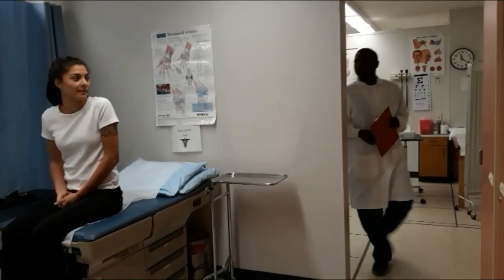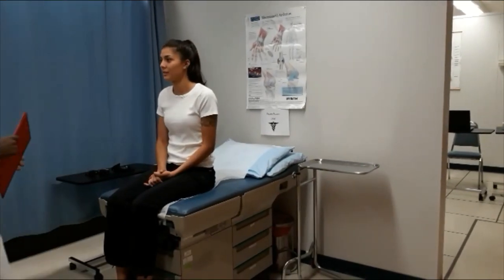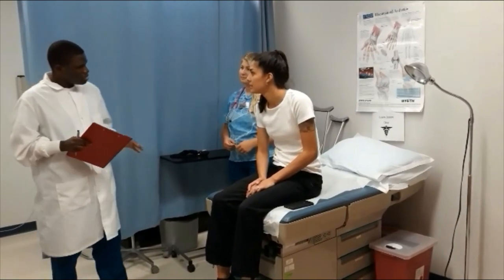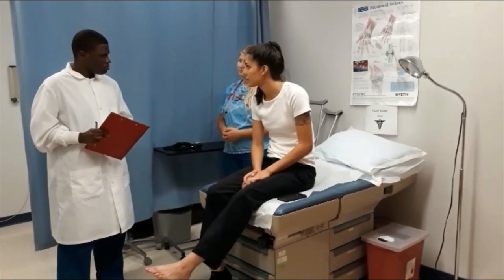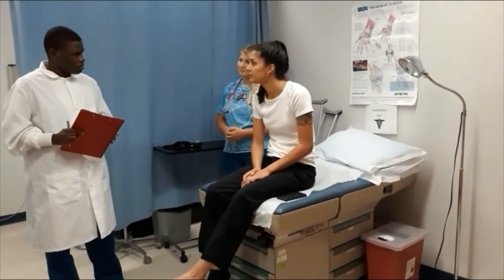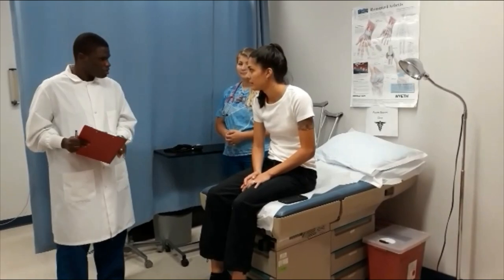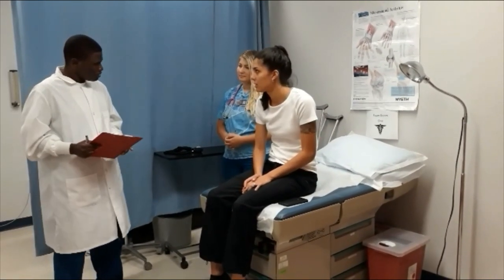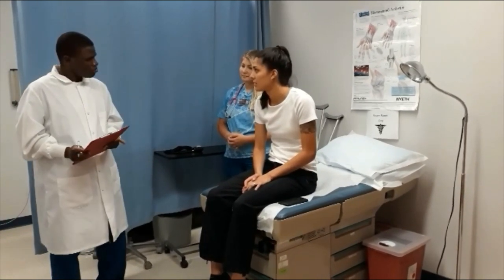Come in. Hi Isabel. My name is Dr. Simon. Nice to meet you. I see you're here for the wart removal. So today I'm going to explain the procedure. First I'm going to place a local anesthetic on your foot to make it numb. Then I'm going to scrape the layer around the area. After I scrape, I'm going to remove the wart. Then we clean the area and place the dressing.